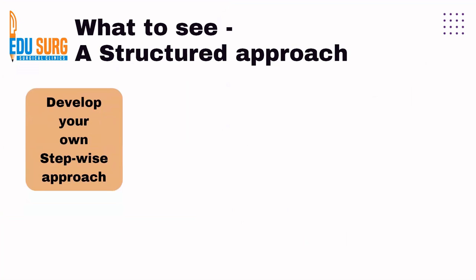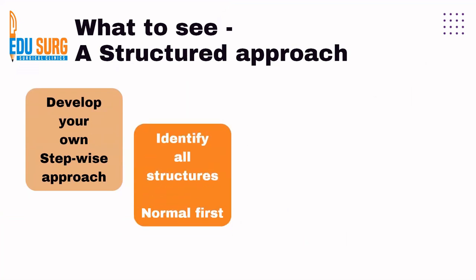Now going to how to see a scan and what to see, I always say that you need to develop your own stepwise approach. The approach that I follow, we are going to give in this presentation, a stepwise approach which you can follow. But as you see 50, 100, 200 scans, there will be a pattern that you are comfortable with. Develop your own stepwise approach.